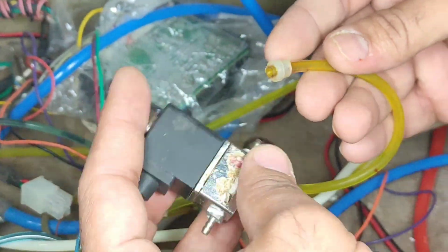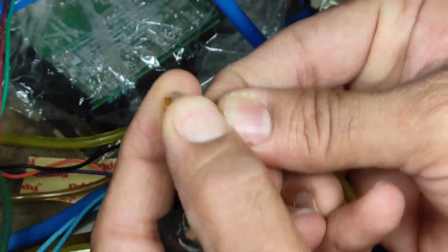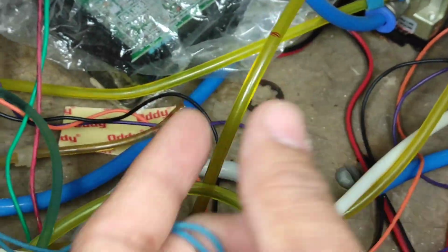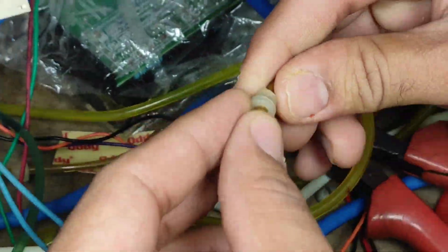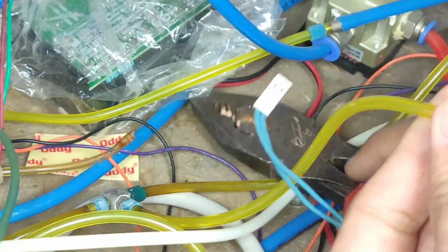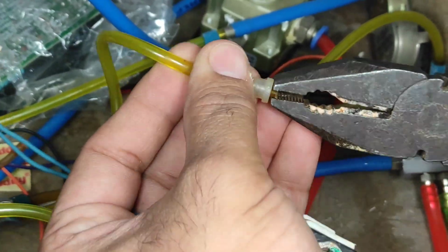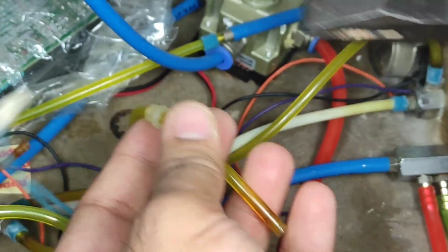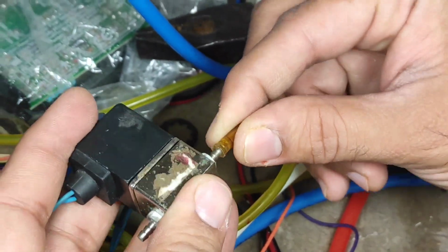I have already done some markings earlier, so now our refitting becomes easier. I will just try to push the extra supportive tubing on top. That is just to give extra support. So I'll try to pull it back, and we will first attach the inner tubing and then the top one. Okay, so here we are now ready, attaching towards the marking side.